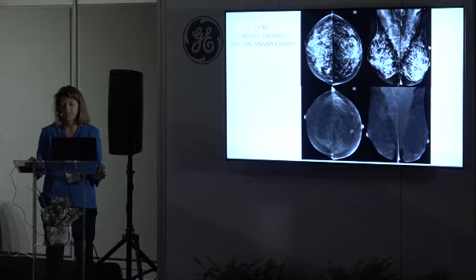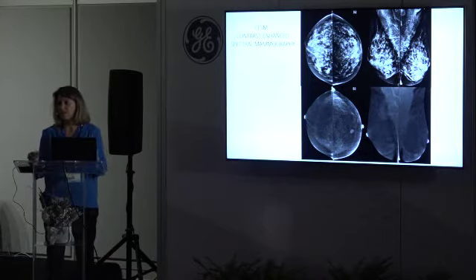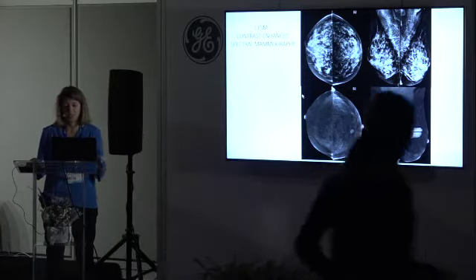You see that all the normal glandular tissue is nearly suppressed in the recombined image, with absolutely no uptake. And usually in comparison with MRI, with contrast examination we have fewer false positives. This technique is only 4 views, and if you compare with MRI today, you have 1,000 to 4,000 images. So for a clinician, for example, that's very difficult to understand.